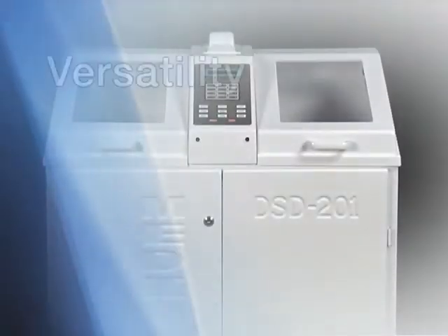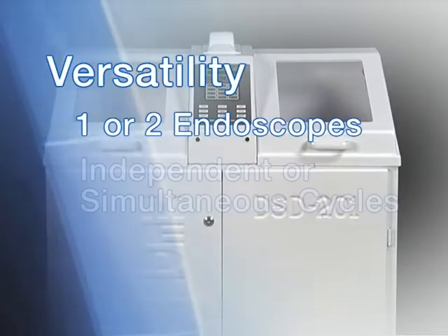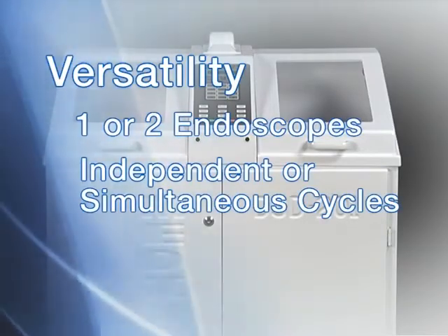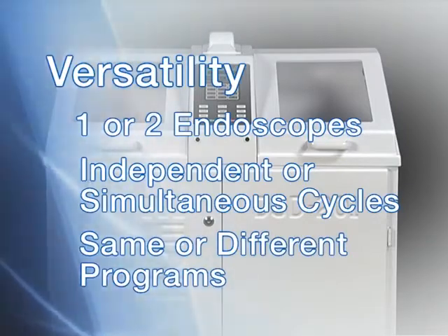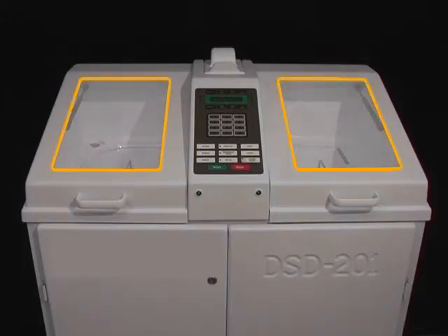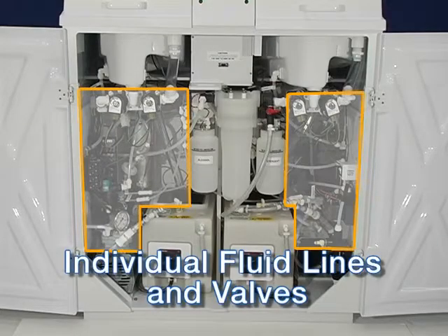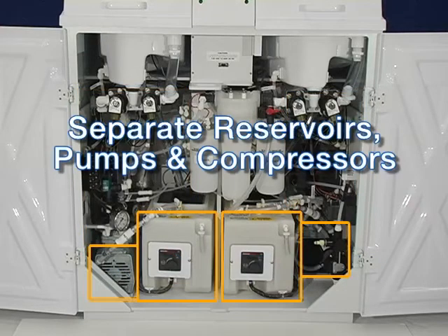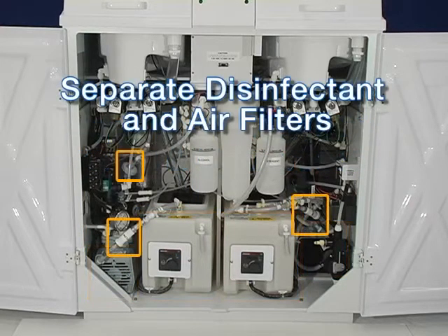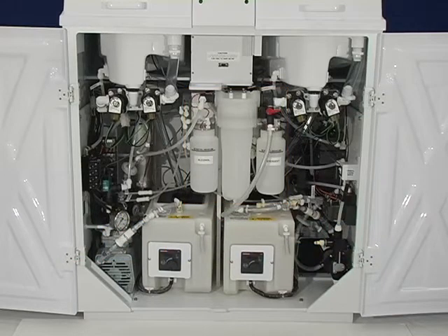The DSD-201 Endoscope Reprocessor is a programmable disinfection unit that allows you to process two endoscopes, either simultaneously or independently, using the same or different disinfection programs. The unit features two independent stations operated by a single control panel. Each station has its own system of fluid lines and valves, a separate reservoir, pump and compressor, and a separate disinfectant filter and air filter. Shared parts include the control panel, water filters, and the alcohol and detergent reservoirs. The DSD-201 functions as two disinfectors in one.